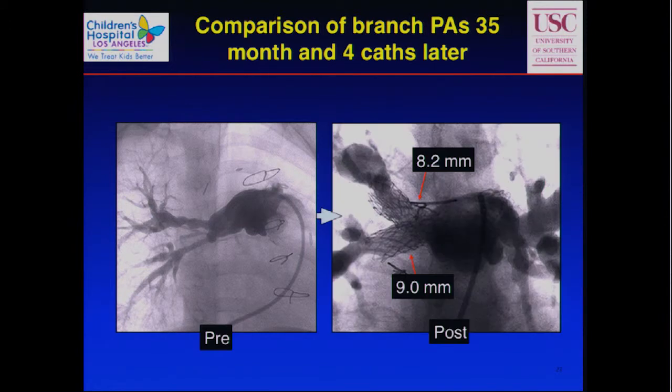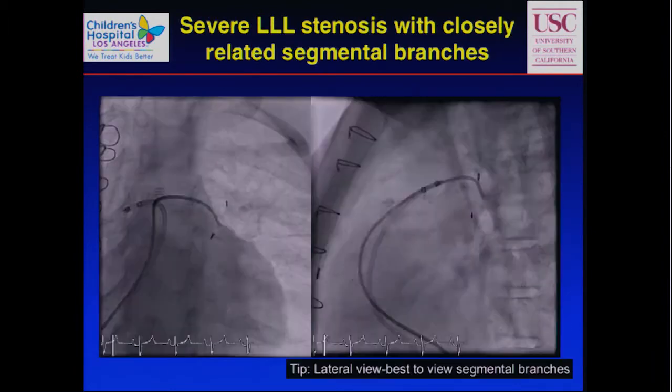And so this is about 3 years later follow-up. How much bigger they are? You've gone from 1.5, and in fact, the lower one went to 9 millimeters. And so how much better it's grown over that time. But you do have to bring them back multiple times to touch up. But the first thing is to put those stents in.